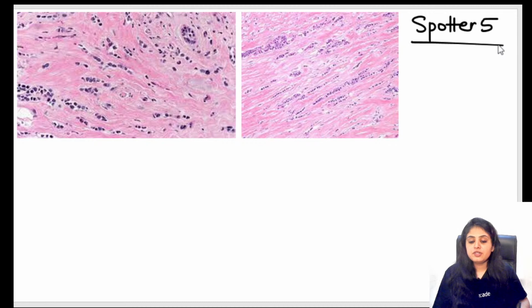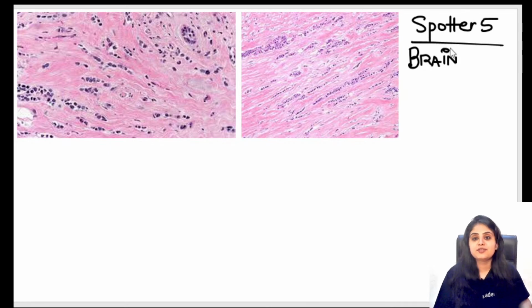I'm not giving you a history because I want you to think. I want you to identify first. History is always available. So no answers up till now. Okay, one answer I've got. Indian file patterns. So without history, without organ also, students are identifying. This means pathology has finally started making some sense to us, right?